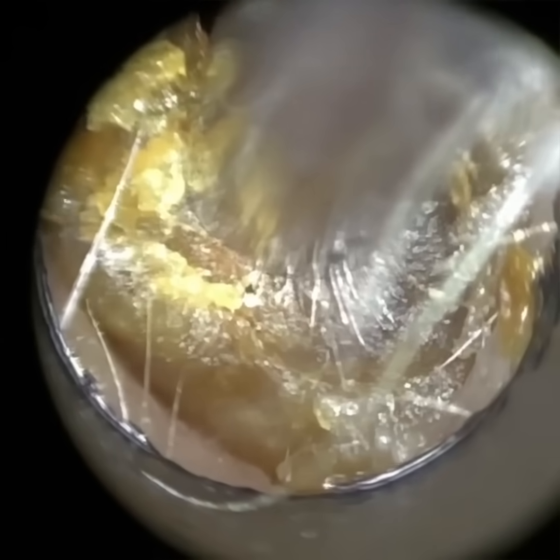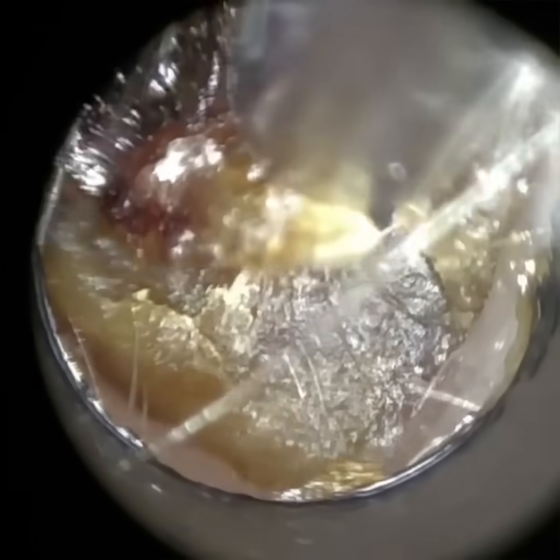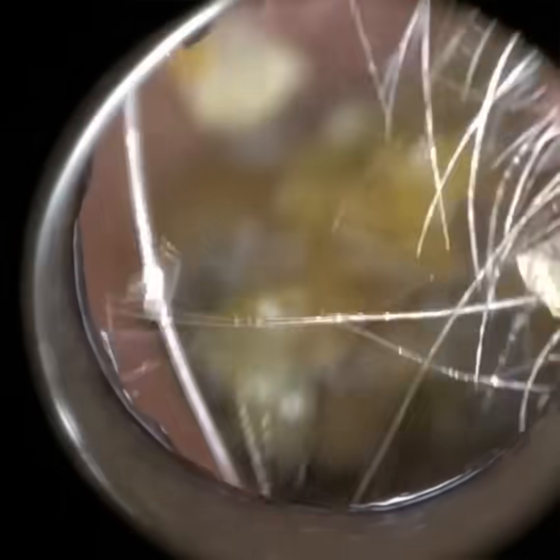Here at the bottom, it's really lodged, so there's a slight narrowing of the ear canal. You may see that, and there's also a bit of a dip, and this wax plug behind that narrowing is larger. So we're having to try to bring this through, which is difficult. And in addition, as I mentioned at the beginning, the skin is strongly adhered to the canal wall. So what I'm trying to do is prise this away.